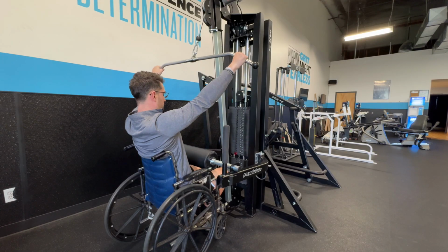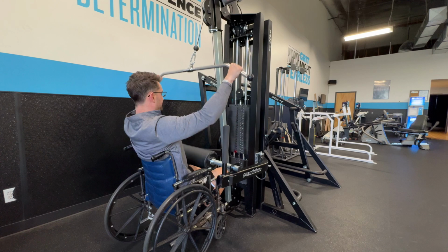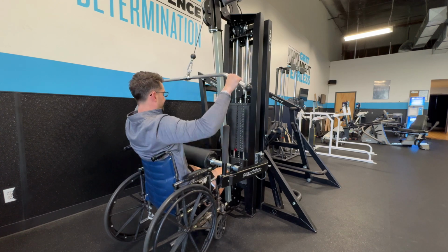In my guess, the 300 pounds that the machine's able to do at the max level feels closer to 100 pounds on a lat pull down. We've seen some of our clients go up to it and be able to do a lat pull down with 300 pounds with one arm. So quite the ego boost on that, but it's one of those things that we would like to see, maybe a way to retrofit or adapt it so that we can actually get the full amount of strength output from that.